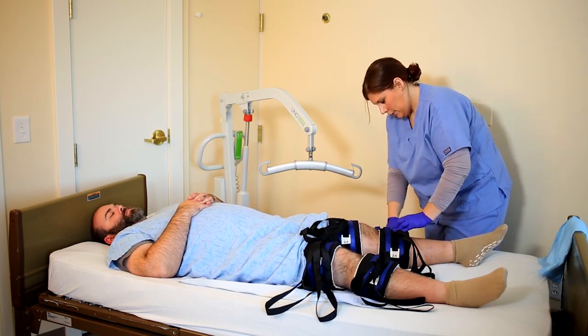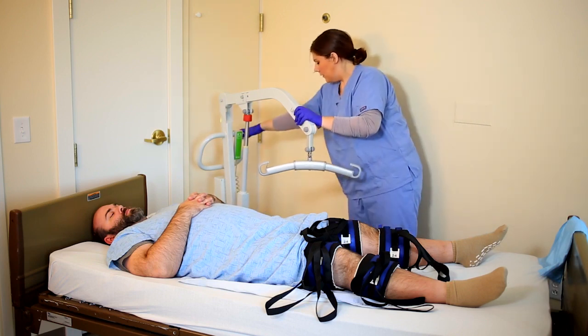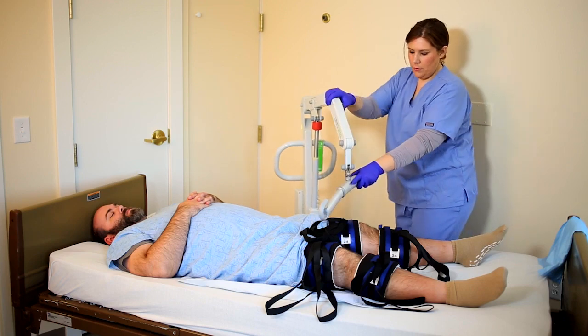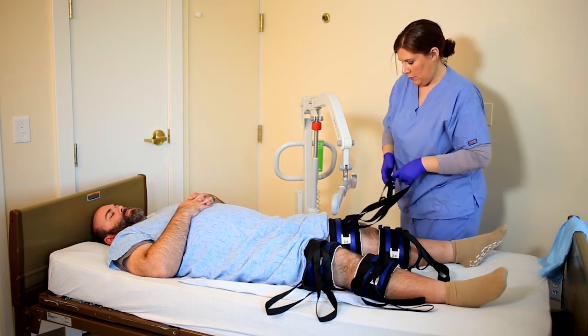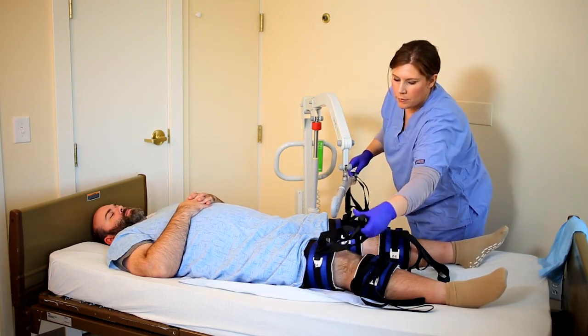Once securely fastened to the legs of the patient, the caregiver will then position the patient lift over the straps, closer to the straps that are attached to the thighs of the patient. She will then attach the straps to the patient lift. The straps will be attached to the T-bar using strap adapters.